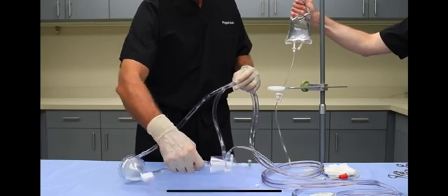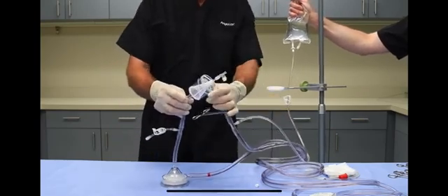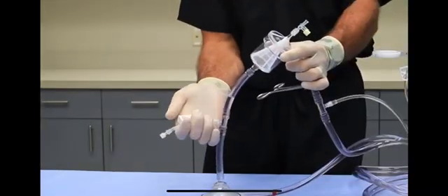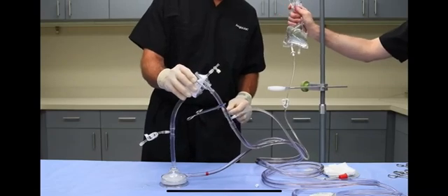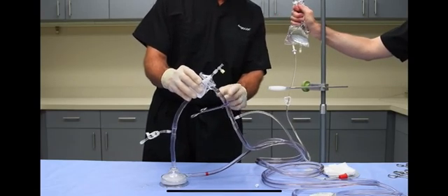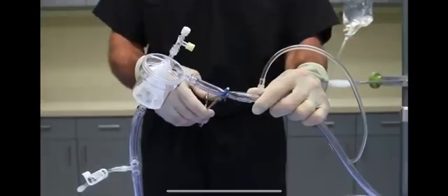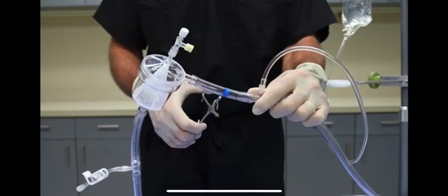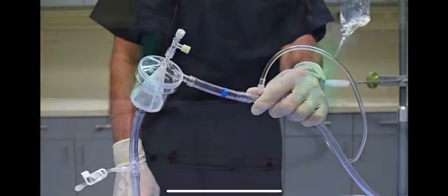As the fluid fills the pump head, open the side port clamp on the T connection and allow fluid to escape, then close the clamp. Allow fluid to continue up into the filter and escape through the stopcock at the top of the filter, then close the stopcock. The perfusionist should now place the pump head assembly into the centrifugal pump and remove the perfusion clamp from the blue line before running the pump to complete de-airing the circuit.